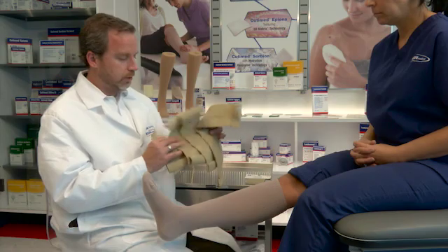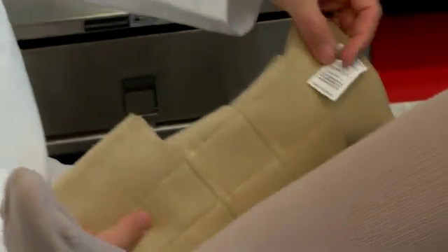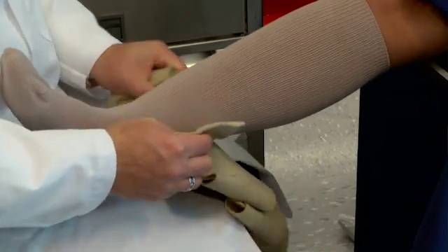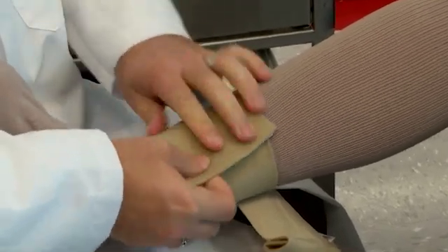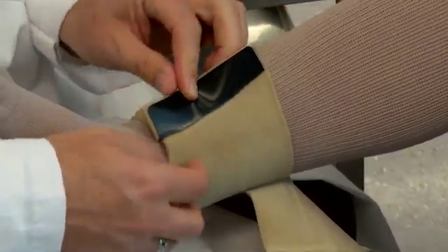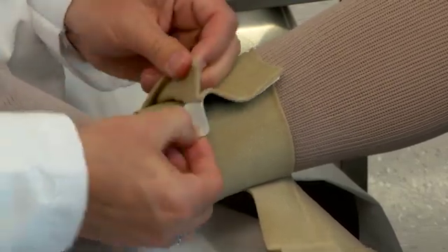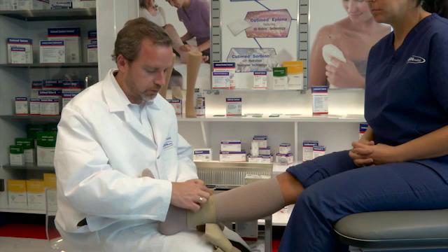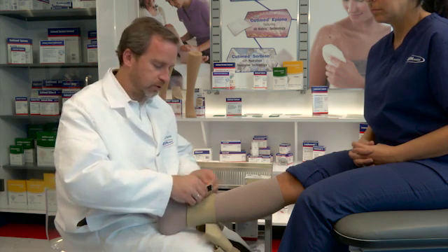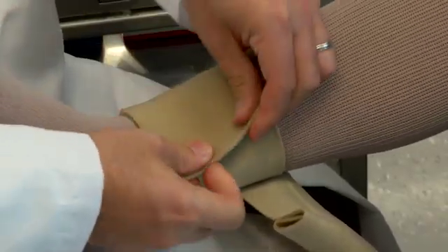After putting on the Farrah Hybrid, you should take the Velcro and fold it back on itself. We will then align the spine with the tag at the top going towards the patient's head. You'll then take the bands, unfold the Velcro, pull it back, and apply at end stretch. Please note that with the Farrah Wrap Basic there is industrial-sided Velcro on the white side, which is semi-permanent, and then regular Velcro on the black side. This allows you to move the Velcro down and trim the bands as the patient reduces, fitting a wider range of sizes. So again, pull the garment to end stretch and put it on.